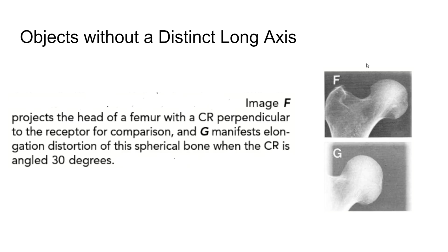because, one, your hip, really the head of your femur coming into your acetabulum, is kind of like an angle. Today is where I really need the skeleton, where you'd be able to see it articulated. So there's already an angle on the bone like we were talking about before, and that's already going to cause foreshortening, without doing anything, really.